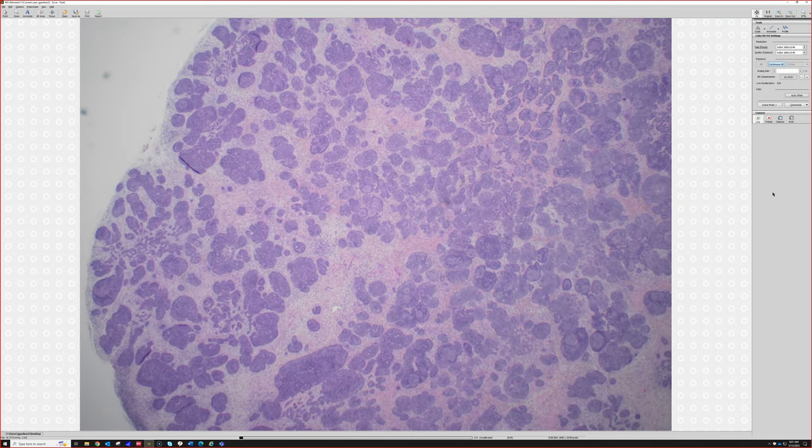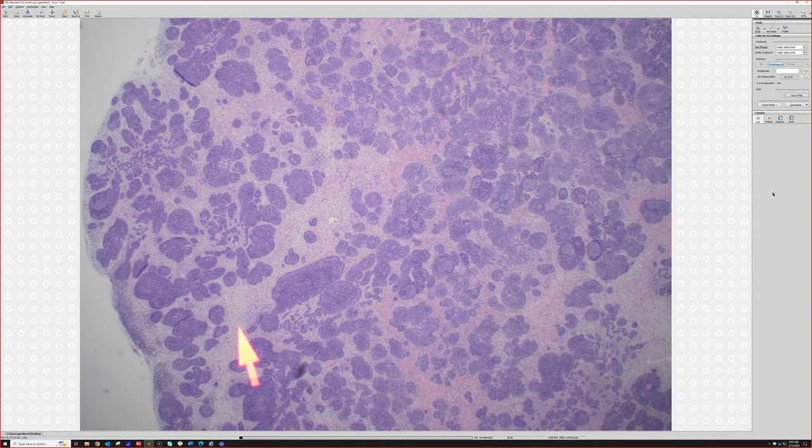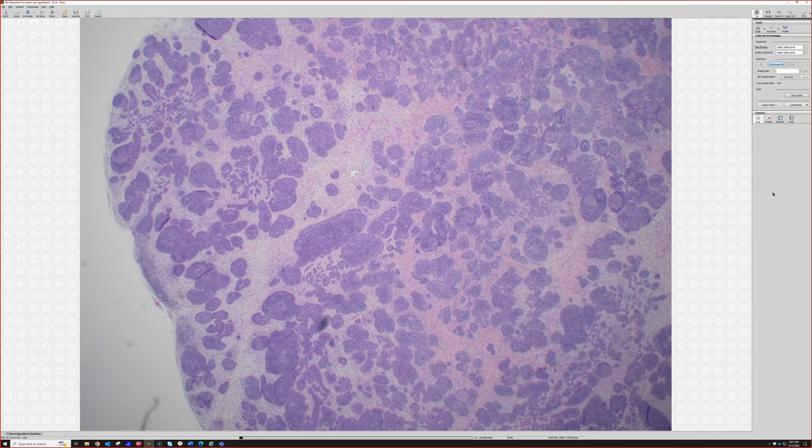The stroma around benign hair follicle tumors tends to be more cellular. It often has more pink collagenous fibrous stuff. It can sometimes have a little myxoid change like a basal cell does, but it doesn't usually have the mucin-filled clefts, or myxoid-filled clefts, between the stroma and the tumor. So even from here, I can see that the stroma comes right up next to the tumor. I'll show you closer in one second.